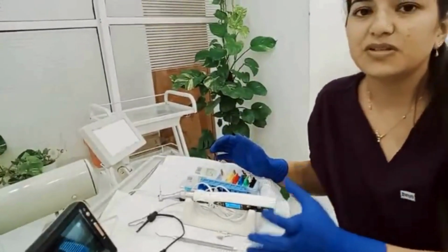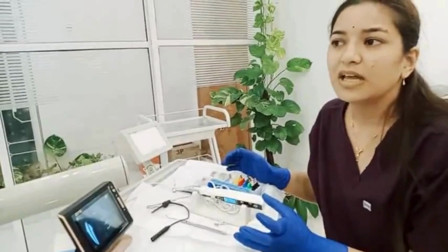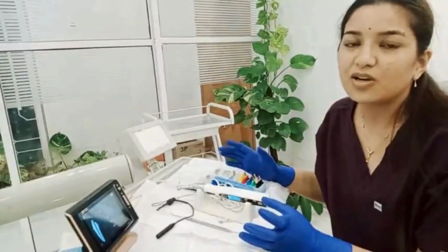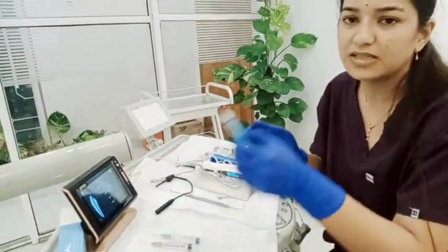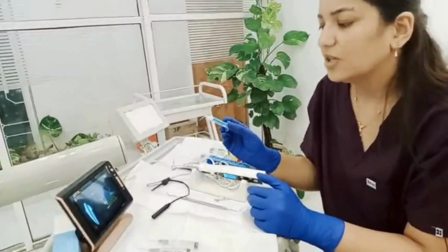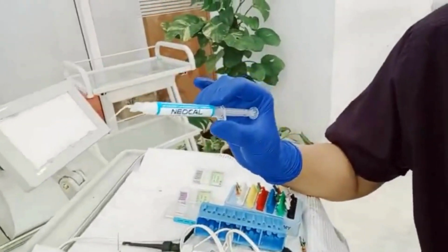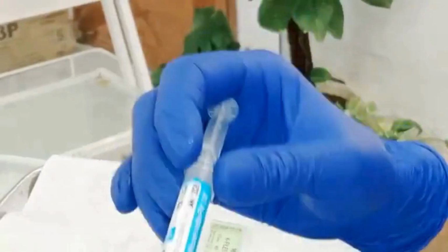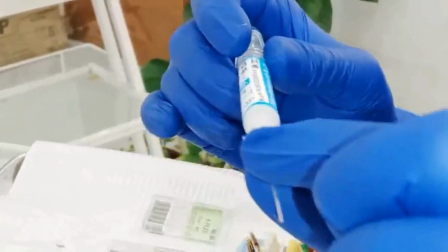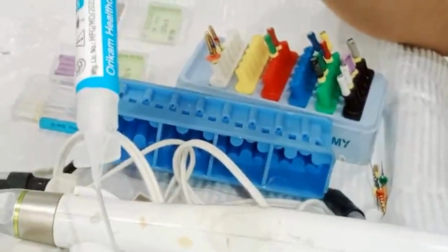Now in some patients, if there is some lesion beneath the apex, or the patient is having a lot of pain, then after doing our BMP or cleaning and shaping, we can place calcium hydroxide inside the canal. This comes in powder liquid form as well as in this tube form. These tube forms are better to place inside the canal. You can directly put this, see how thin is this tube here. So we can directly put it inside the canal.